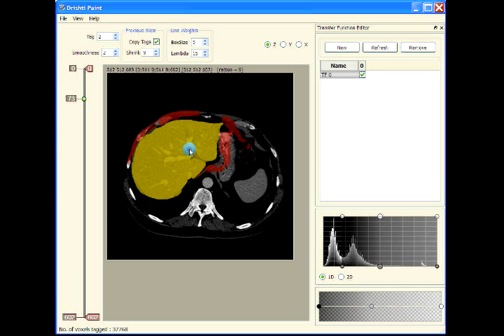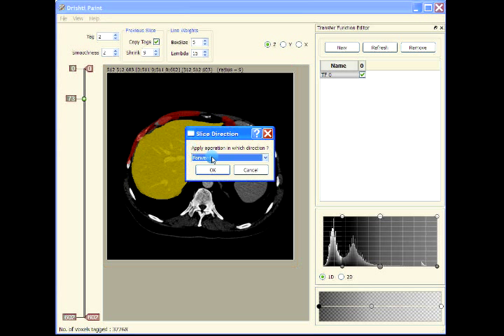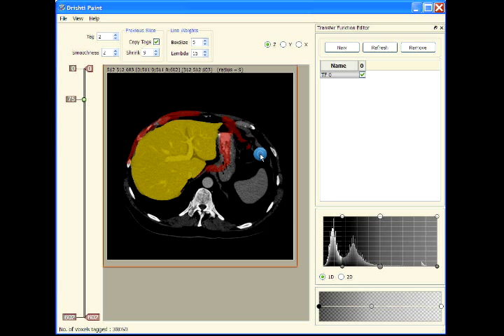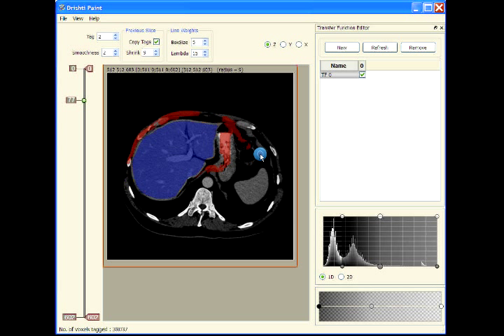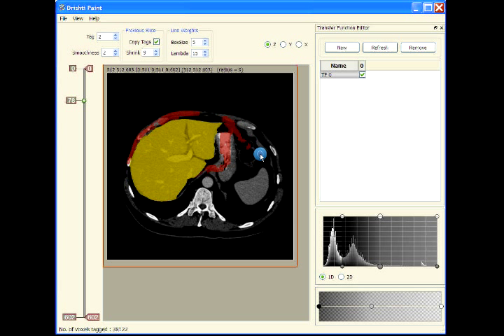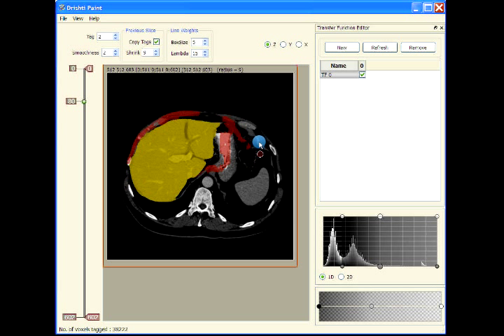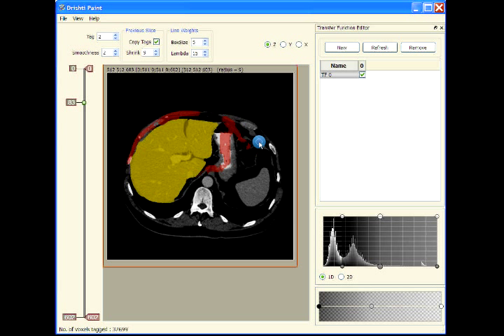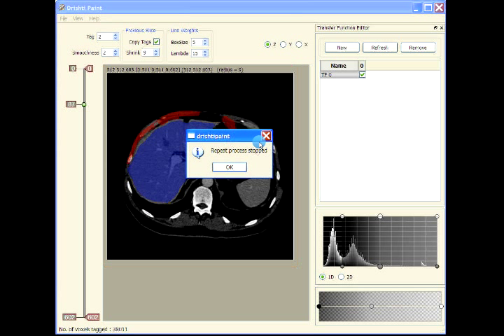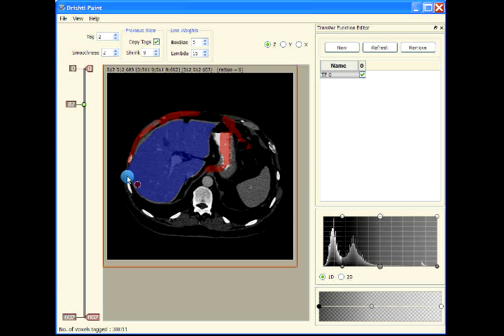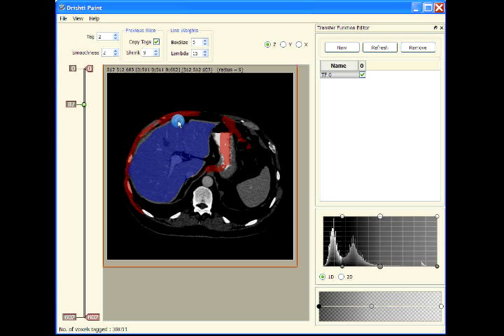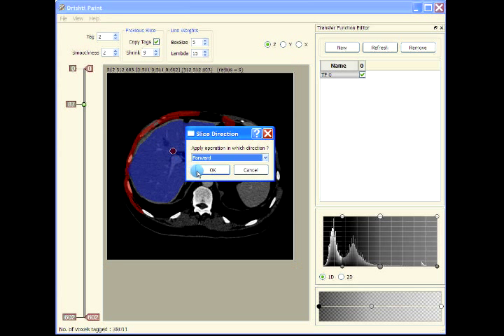Let me press Shift-T and go forward. Let's see how it fares. If it's going bad, we can press Escape and stop the process. We'll just put all these things here as background and continue with the process.